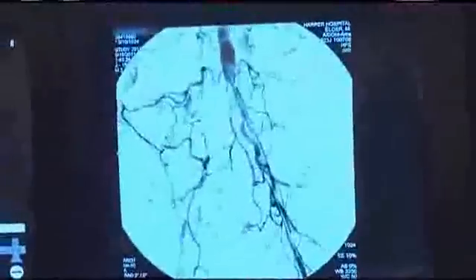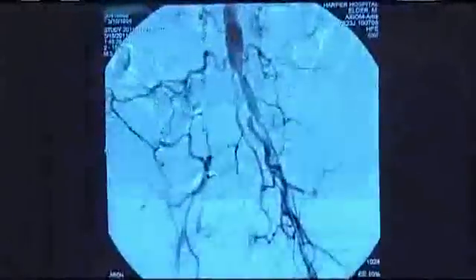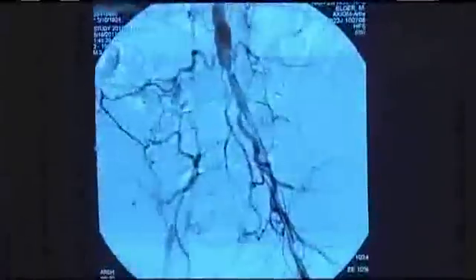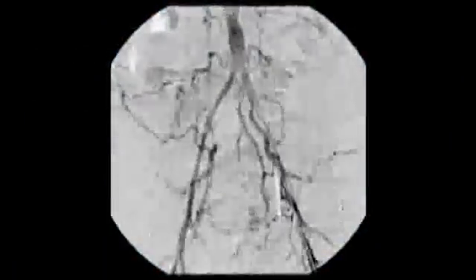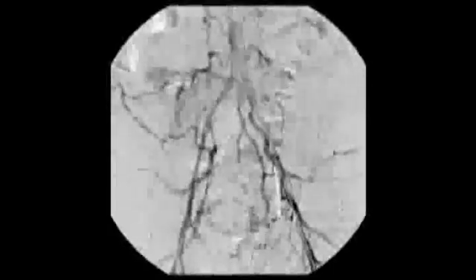The monitor on the right shows our original image, which has a chronic total occlusion of the right common iliac extending to the right common internal and external iliac with reconstitution in the common femoral. There's a focal lesion at the left common iliac. Now we're going to take our post-angiographic pictures. We're seeing a formal injection, and you can see we have good TIMI3 flow and good apposition of the stents. The reconstructed carina appears not to have any obstruction, and we have very good luminal flow. It's TIMI3 flow bilaterally, and if you compare it to the screen on the right, that was the lesions before. You can pan from left to right to see the before and after shots.